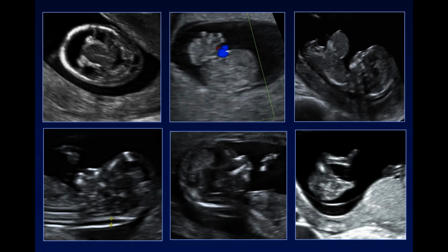Similarly, we've had an opportunity to look at the fetus within this gestational age window, and we've become adept at recognizing major congenital abnormalities. If we look at the fetus in a systematic way, we can examine the cranium. You can see in this fetus there is a single monoventricle. Your thalami are fused, and this fetus has alobar holoprosencephaly.